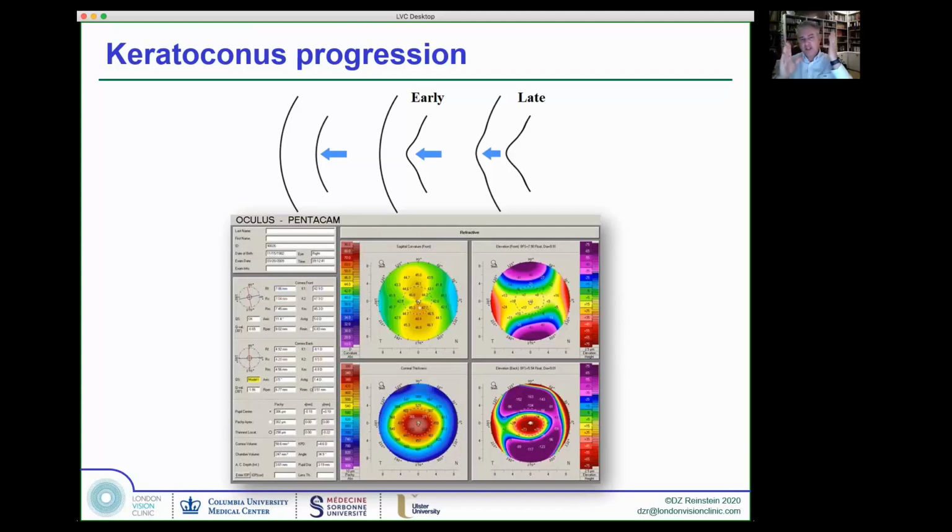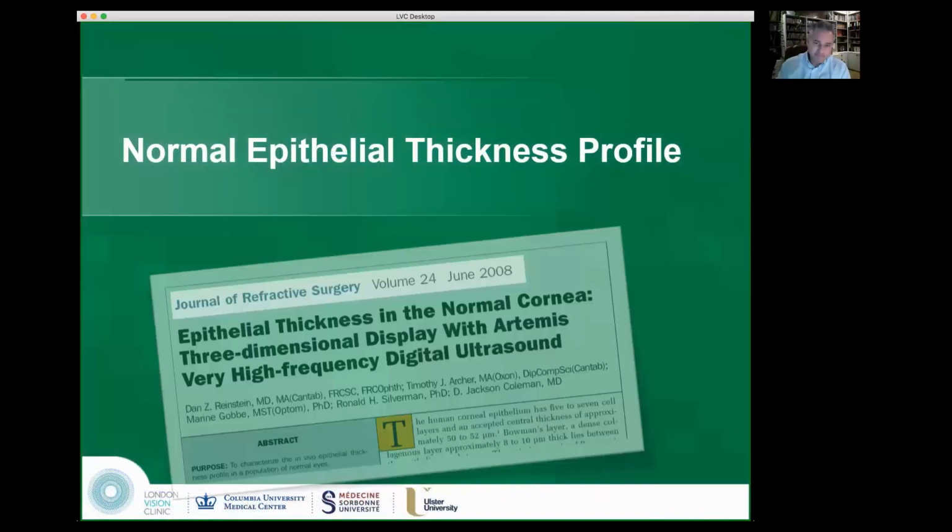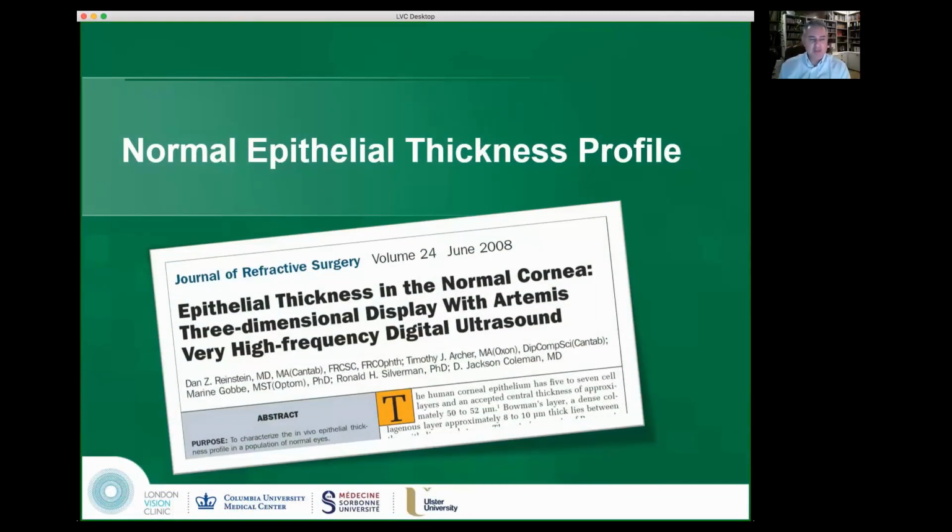Right? So if you've got a slit of light going through the cornea, you're calculating the position of the back surface through the cornea from your imaging system. There are inaccuracies inherent based on the refractive index changes. And so this limits our ability to pick up what might be an abnormal back surface, because it might be just noise. And so here's where my contribution came in.